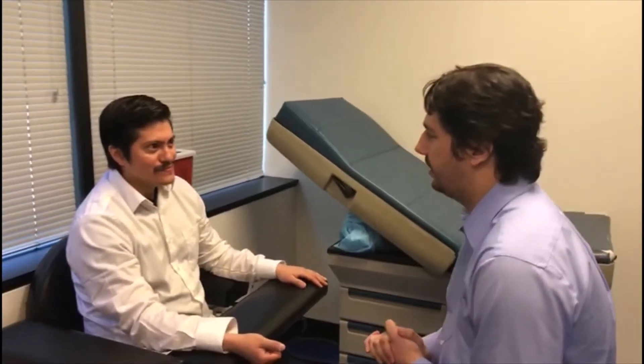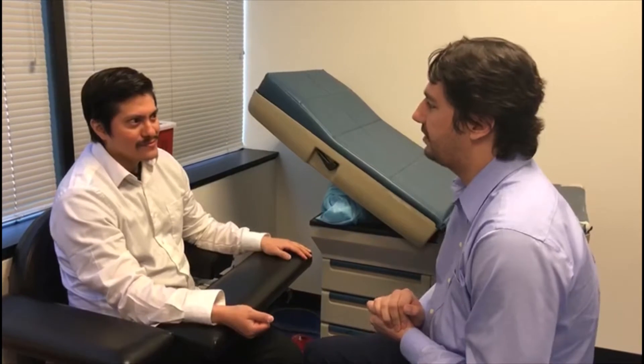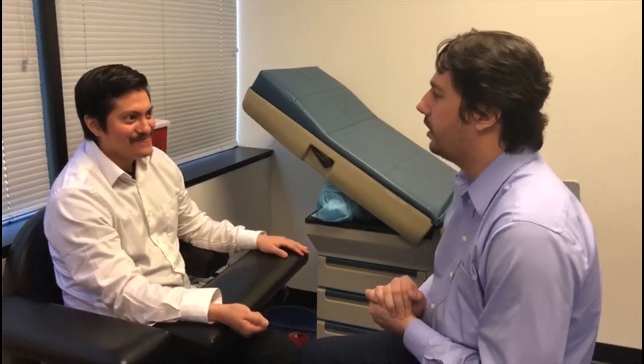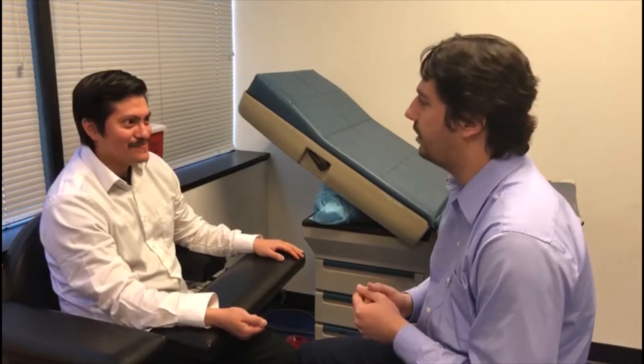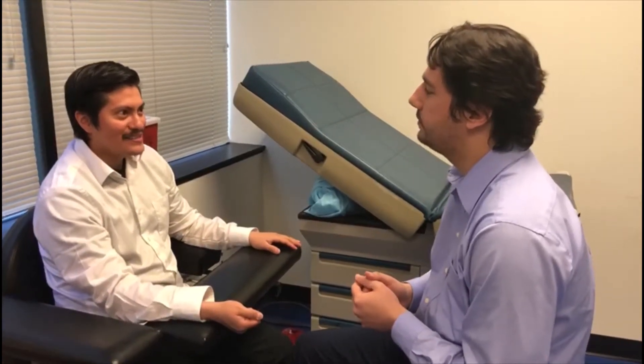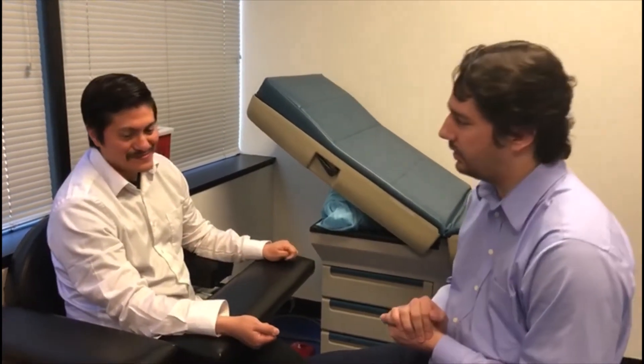I'm Alex, the head phlebotomist here. The doctor has ordered a few tests. May I get your first and last name please? Denver Vasquez. Can you please spell that out for me? D-e-n-d-e-r. The last name? V-a-s-q-u-e-z. And your date of birth? January 1, 1985. I would be cross-referencing with the requisition form, making sure it checks out and that it's the right patient — because the wrong test on the wrong patient could greatly alter not just his results but somebody else's.